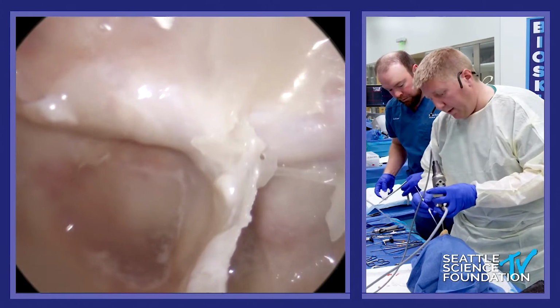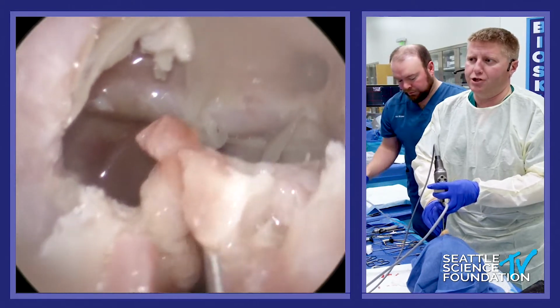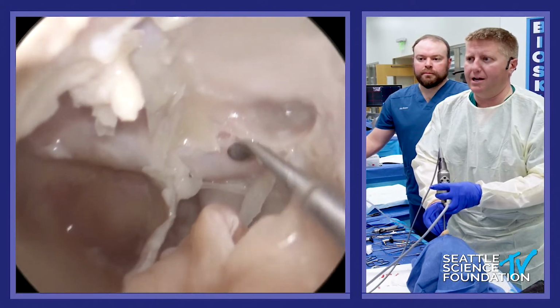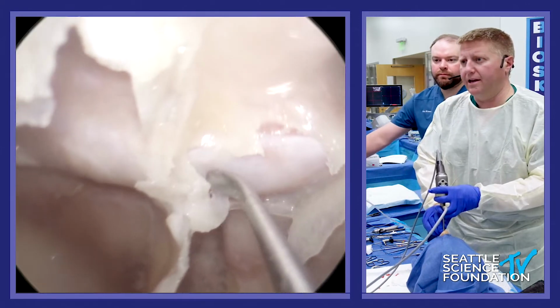And were we to take our piddly nasoseptal flap, which again, I made short sort of on purpose because we were saving it, what we do is we rotate that back into place over here in order to cover that defect should you choose to. And that's a nice option.